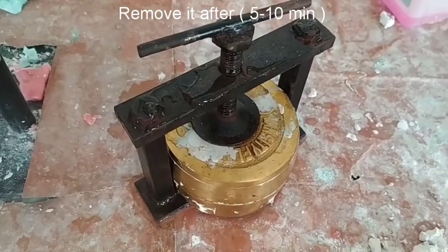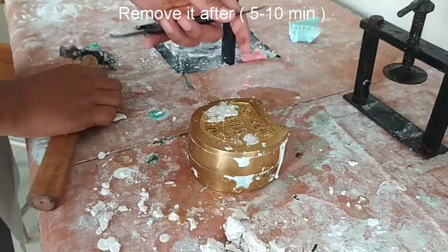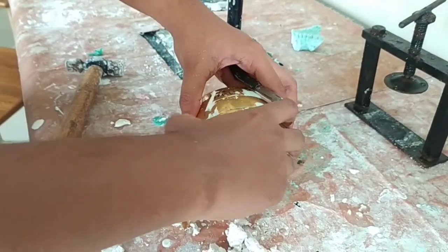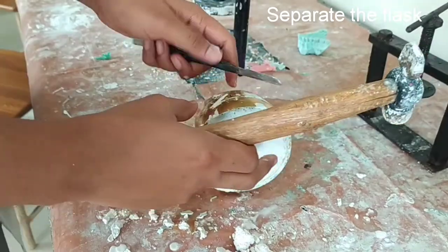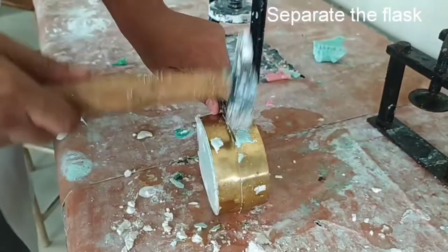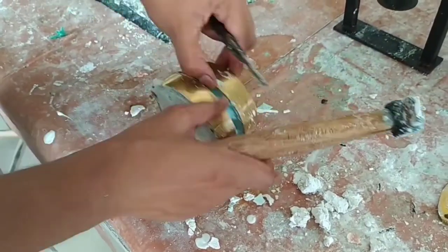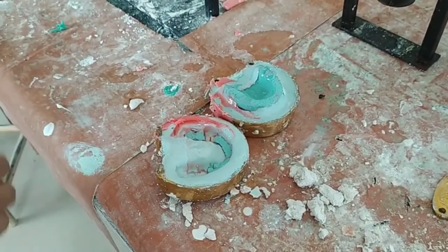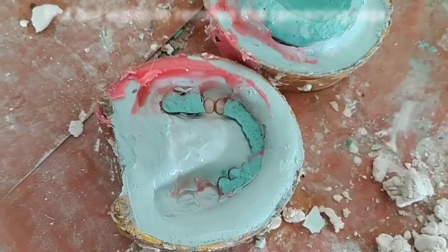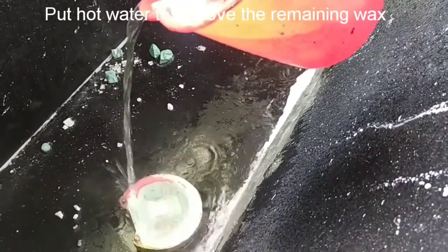After removing it from the de-waxing unit, remove it from the clamp and open the flask with the hammer and the wax knife. The flask is now open and we can see our teeth are embedded on the other side, and there is a lot of extra wax present. We will pour hot water onto it to remove all the wax.